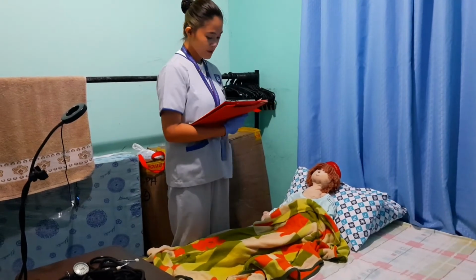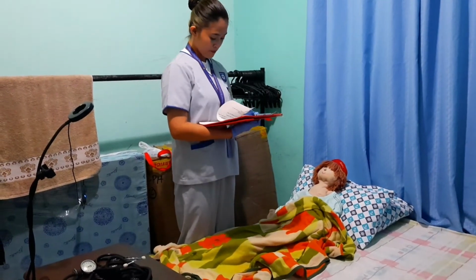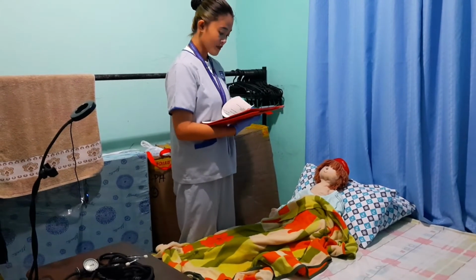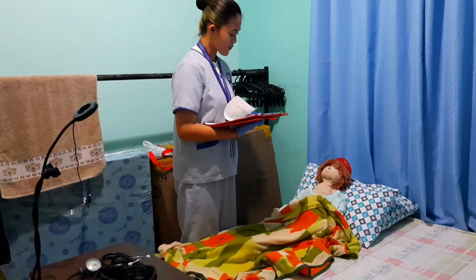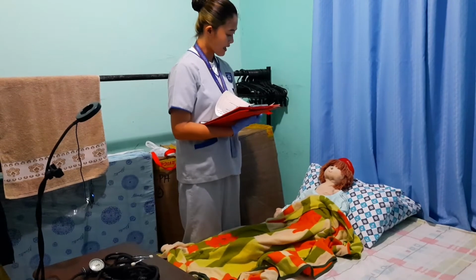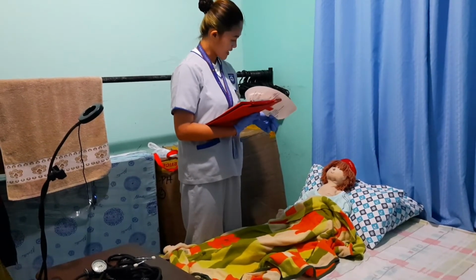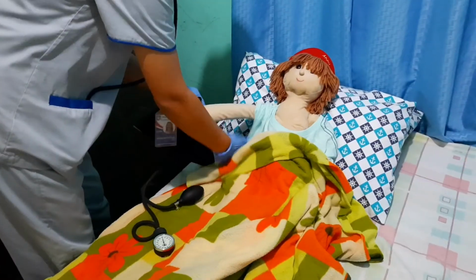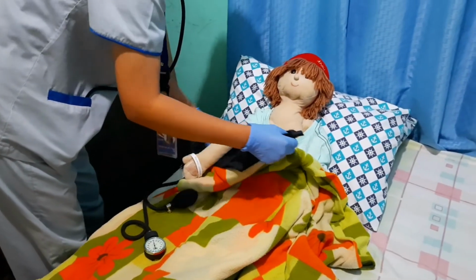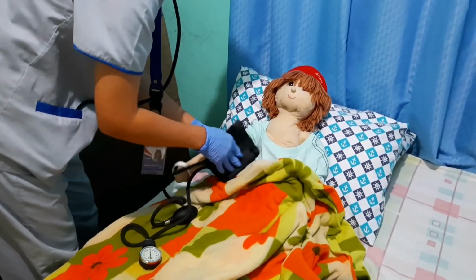So, I will be putting this Perilight for about 15 to 20 minutes, but every 5 minutes, I will ask you if you feel any different sensations like numbness and any kind of skin maceration and discomfort. Now, we have to take the vital signs for baseline information, and if there's any abnormalities, we have to refer it immediately.